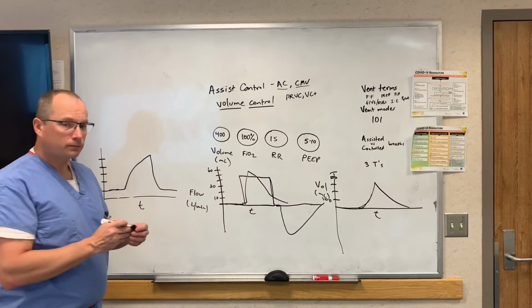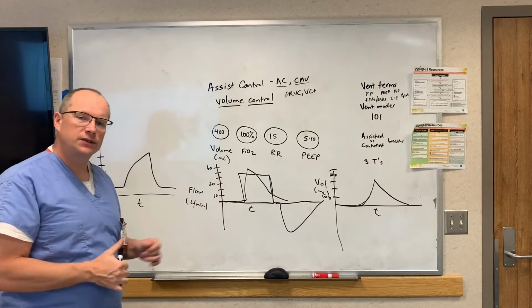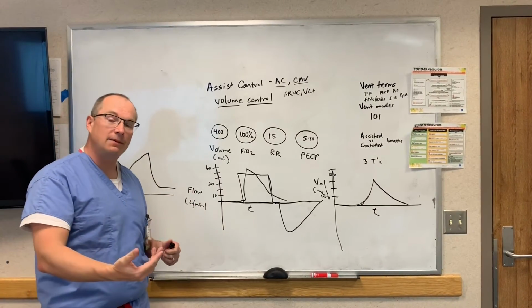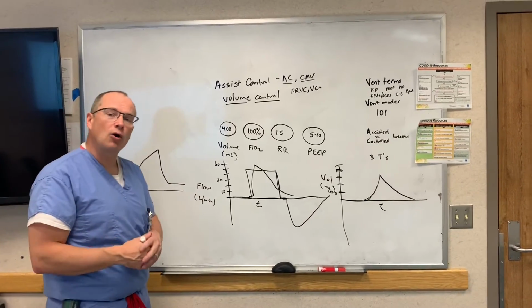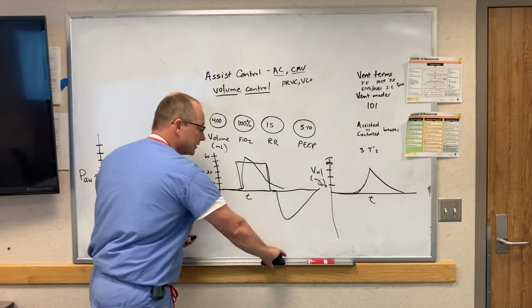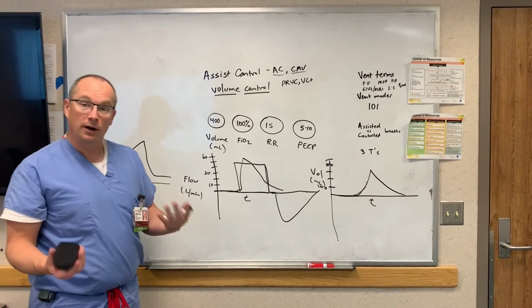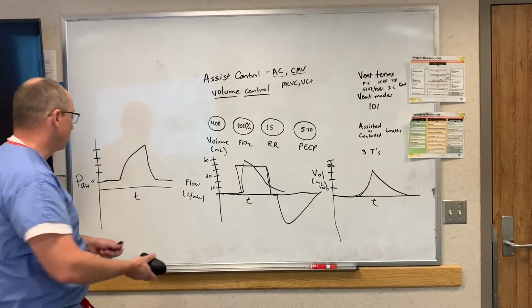All right, last but not least, I'll talk a little bit about just airway pressures and some of our normals that we look for. We'll be talking about airway pressure significantly later, because in ARDS patients, we can often have problems with the peak airway pressure and what we call a plateau pressure. So I'm just going to talk about that briefly when it comes to vent terminology of what a peak inspiratory pressure and plateau pressure are.